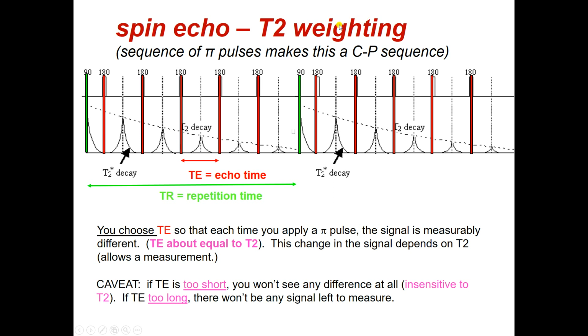Well, if there's a thing called T2 weighting, which you need to measure the T2 relaxation time, then there must be a thing called T1 weighting, and we're going to see that that is true in a minute. So for people who are worried that there's no equations to this, sure there are. Here's the equation. I know this looks scary, but it's not all that scary. We're going to see there's three parts to it. There's a term here that's the density of the protons. There's a term in square brackets, which is just going to depend on T1 only. And there's this term hanging at the end, which depends on T2 only. So it's really only 1, 2, 3 terms to this. And you'll know what each one of these 3 terms does in a bit.